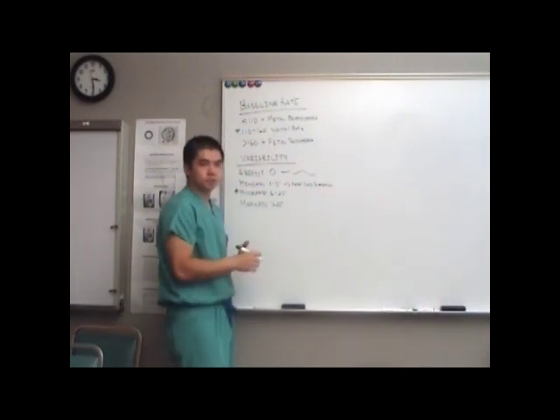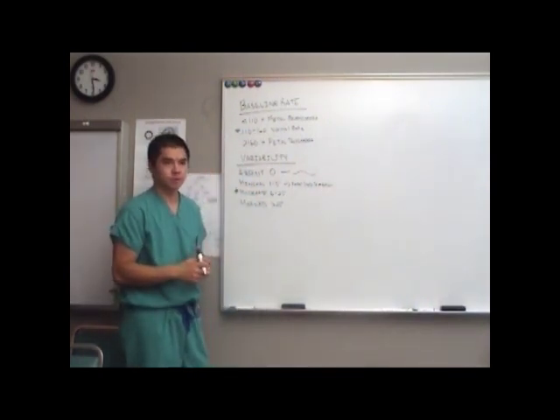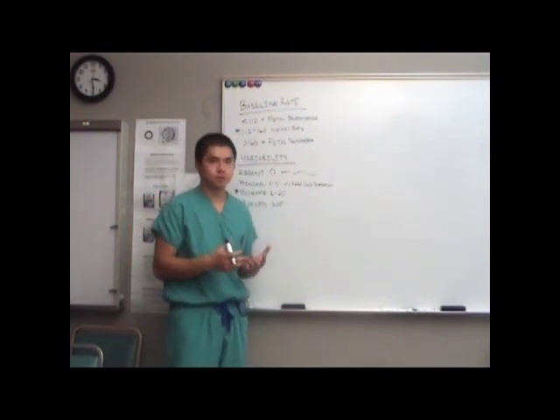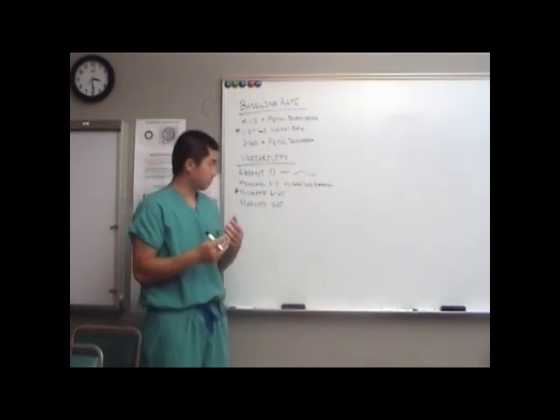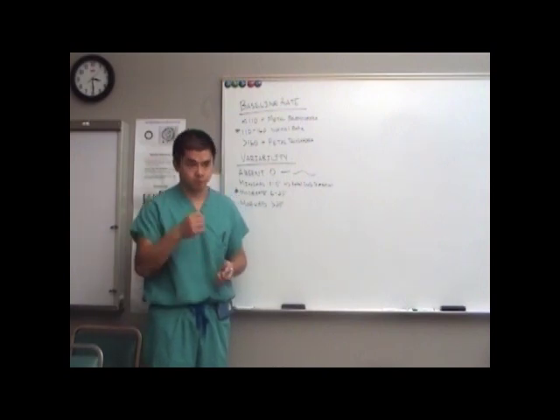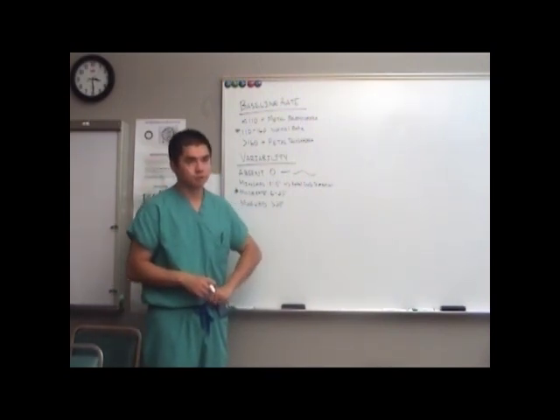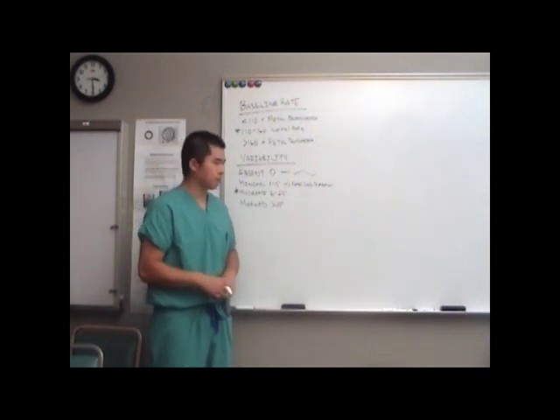What are those 2 ways to do scalp stimulation? Yep. There's a digital scalp stimulation during the vaginal exam, or there is vibroacoustic stimulation where you use a vibroacoustic device, put it on mom's pelvis just over baby's head, and vibrate the baby's head.